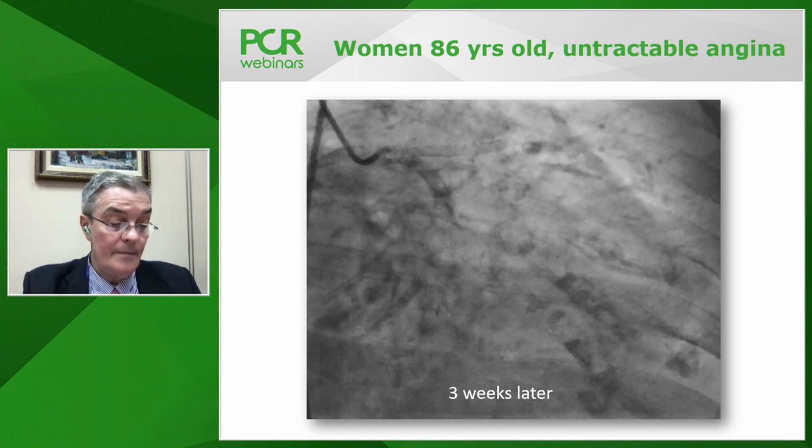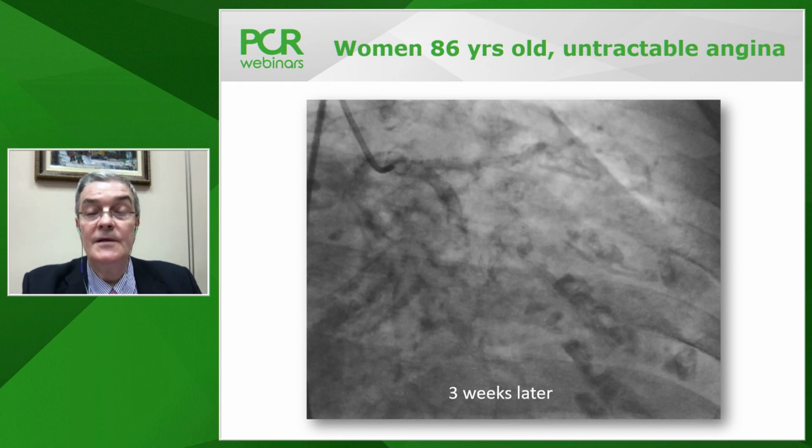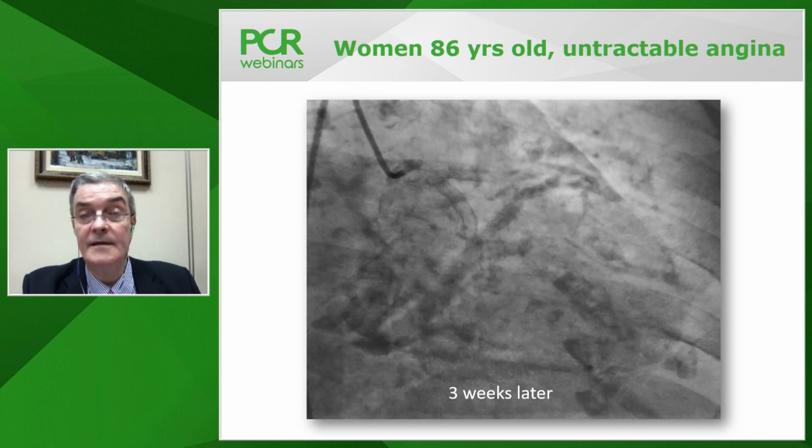Thierry, practical question from Randa Tabak. What about the mid lesion in the LAD? It seems there is another mid lesion, probably one after the septal branch.